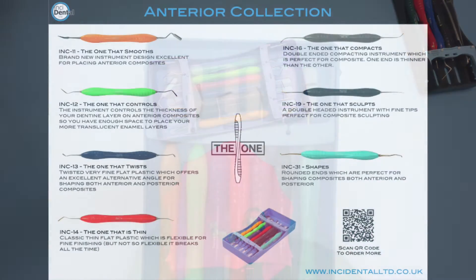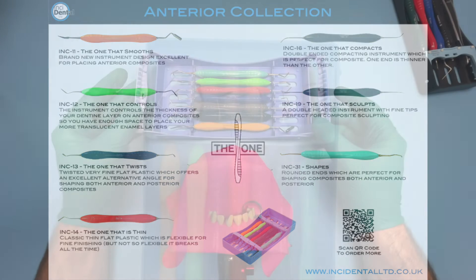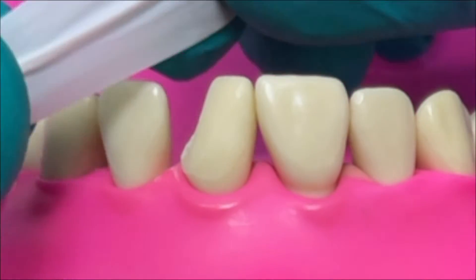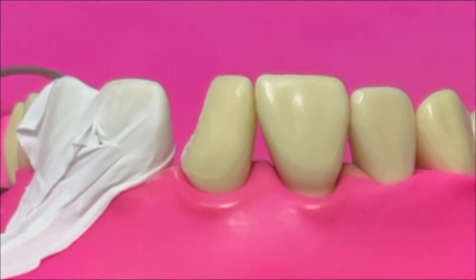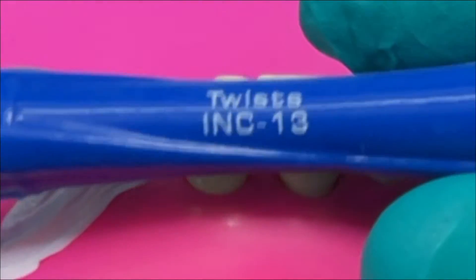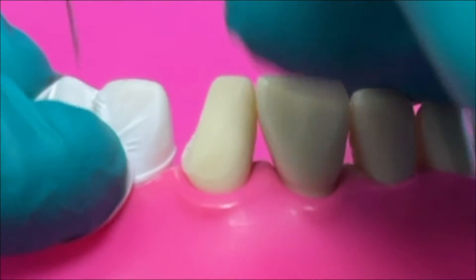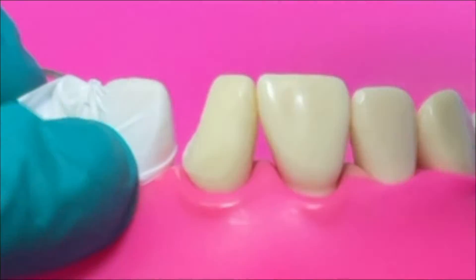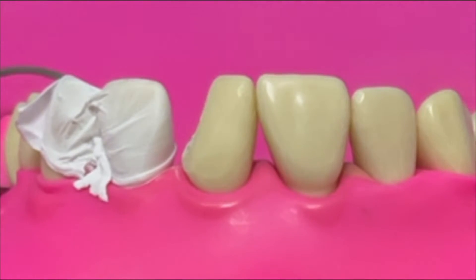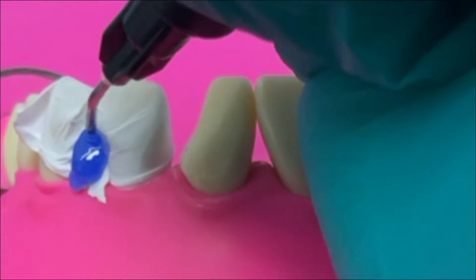I thought the best way to demo this would be to do a couple of anterior exercises and show where the instruments are useful. So let's start with a class 4 cavity. A couple of tips: I'm going to do the bonding procedure but I want to protect the adjacent teeth from gluing together, so I like to wrap PTFE on the open side where the contact is open. I'm going to use the first instrument we're going to talk about, which is the twist instrument. It's a very fine, well-made flat plastic but the angle is slightly off-angled, which is particularly helpful for anterior work because it makes it easier to work with your wrist nice and flat.